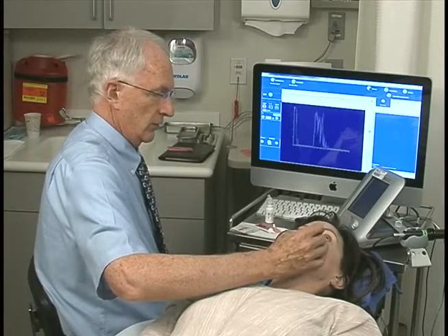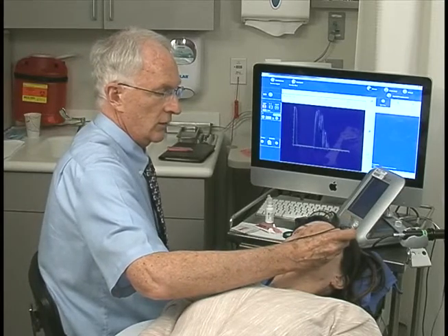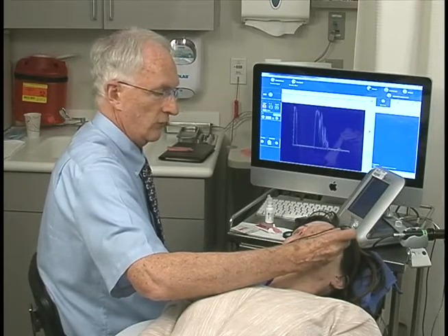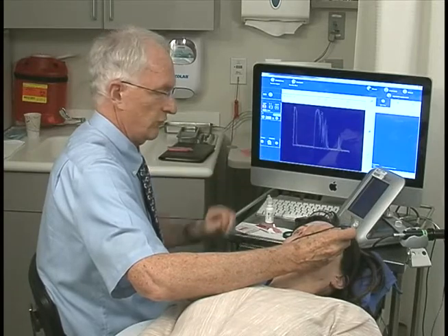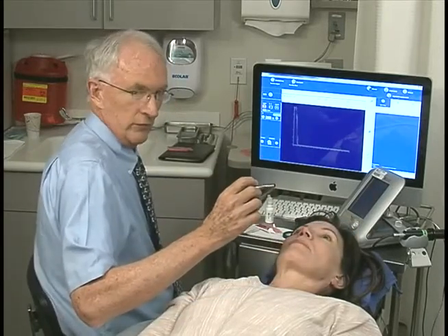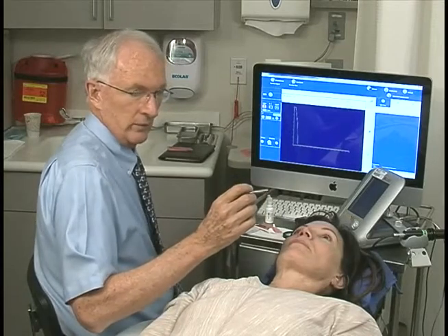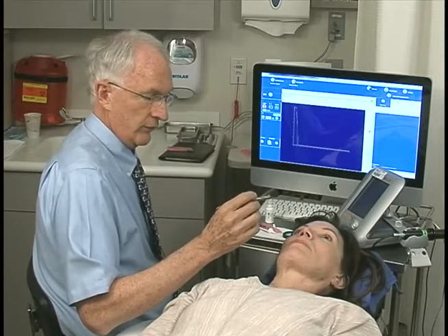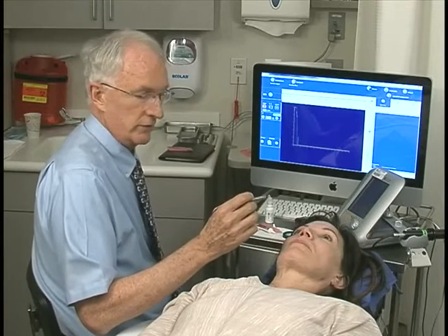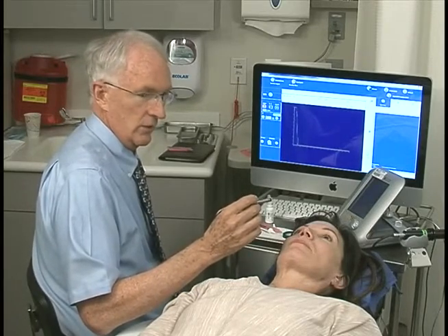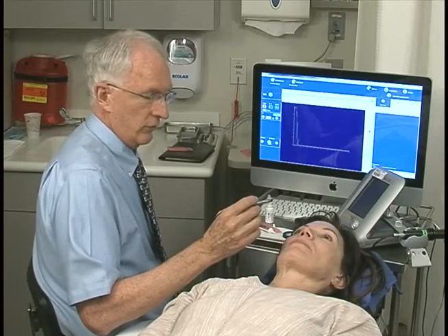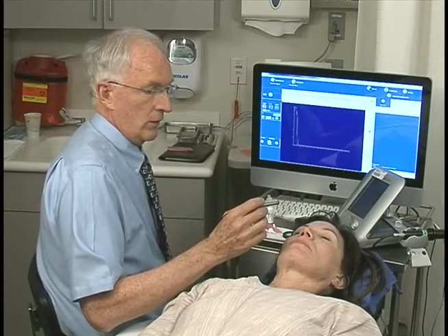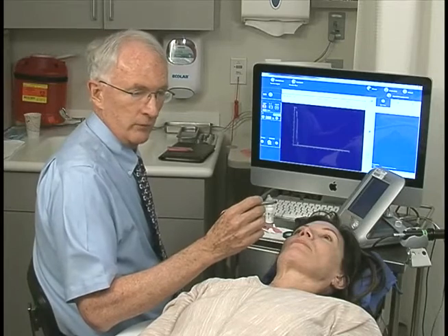I scan the superior orbit. I then place the probe at the 4 o'clock position and scan the superior nasal orbit, going back and forth trying to maintain perpendicularity of that initial retinal spike. I can then concentrate on specific orbital structures, especially the extraocular muscles and the optic nerve. This allows quantitation of these structures, which is very important for following pathologies such as Graves' disease, myositis, or other muscle conditions. The optic nerve allows me to evaluate the nerve for swelling, as may be found in increased intracranial pressure with optic nerve fluid, or a tumor of the nerve such as glioma or meningioma with nerve thickening.